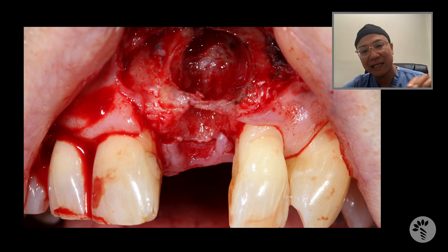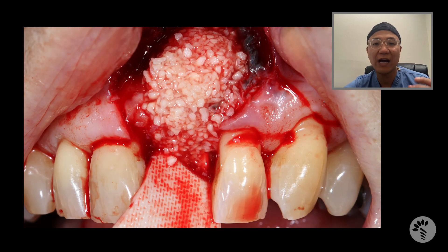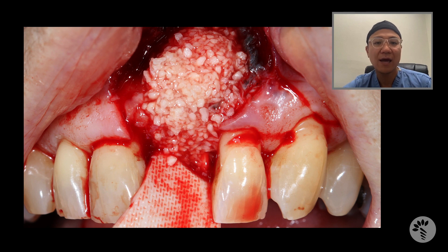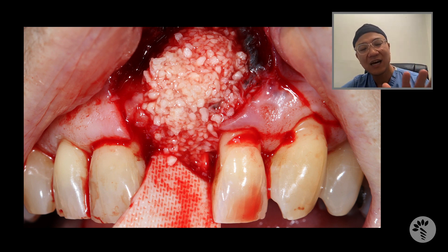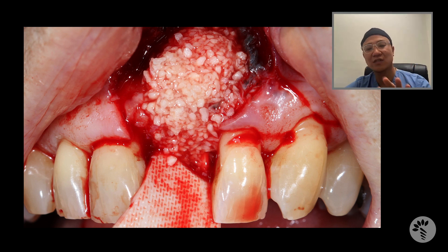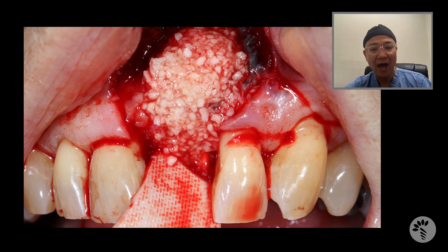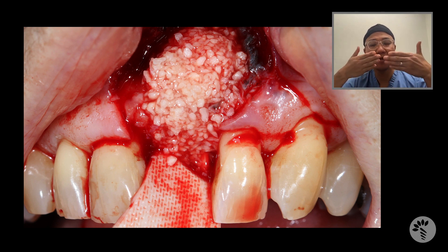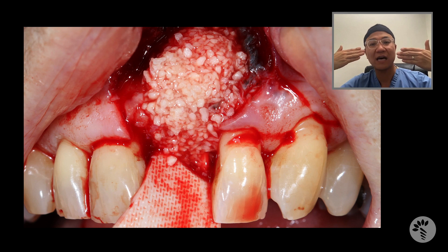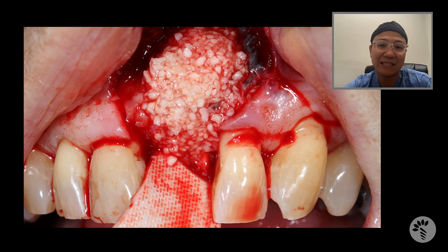After I completely removed the granulation tissue, I placed bone graft, which was hydrated with platelet-derived growth factor. In these kinds of cases, you have to not just do socket grafting, but graft beyond the socket. Why not? Because you have access to add more bone. And as you know, people lose bone in the maxilla from buccal towards palatal over time, so I want to make sure I give enough hard tissue for this potential implant site.